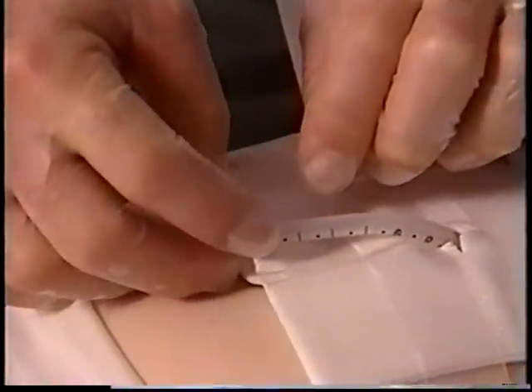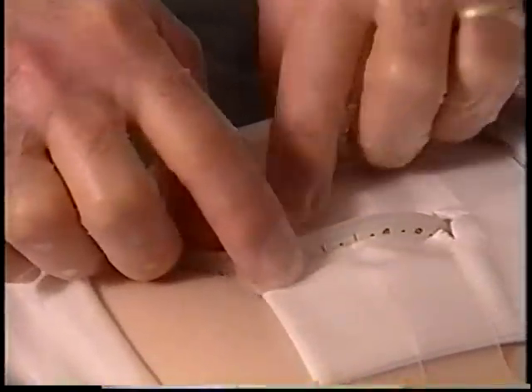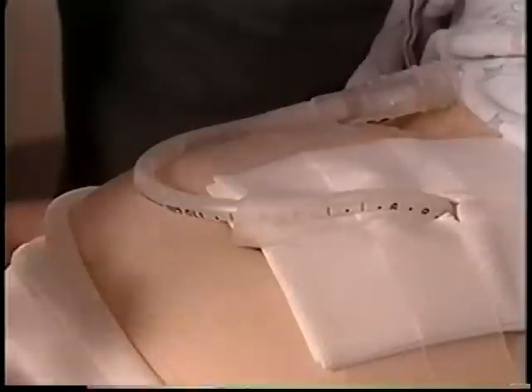There are various methods of securing the PEG tube. Stabilizing it to the abdomen with tape is often used initially, although patients may use a variety of other methods.